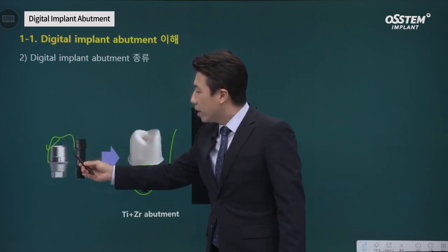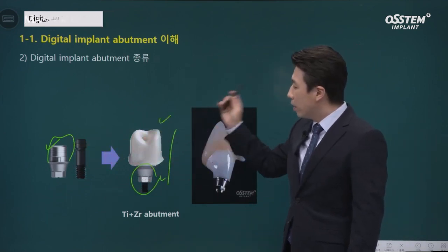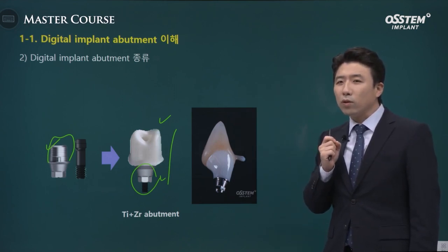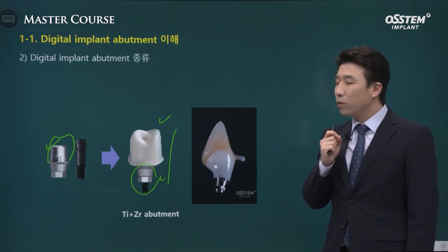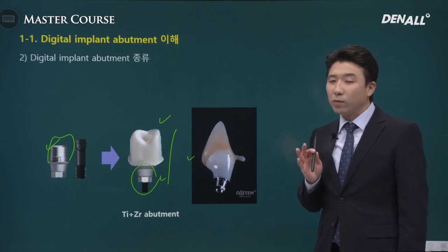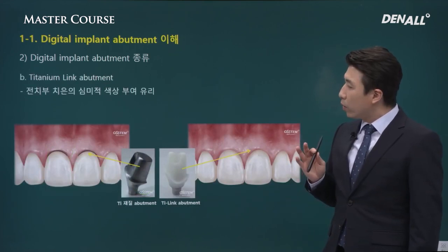Now we move on to the abutment designing phase. This is a hybrid type abutment where it can be attached. When you want to maximize aesthetics, such as in the anterior zone, it can be used. Once crown prosthesis is complete, this kind of design can be provided. I've talked about aesthetic results.